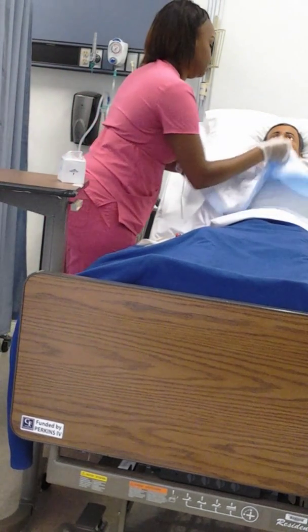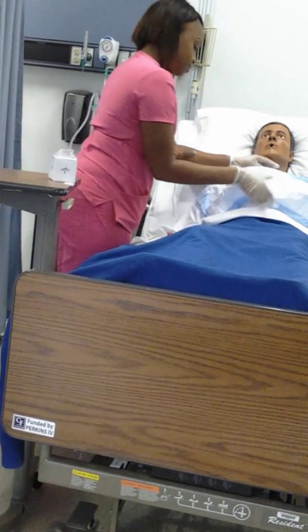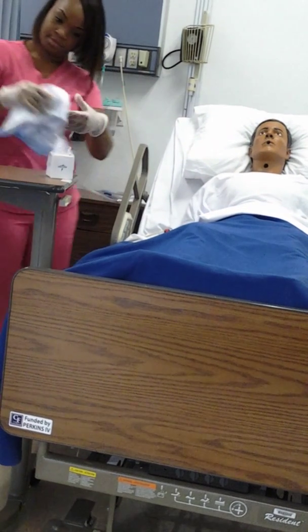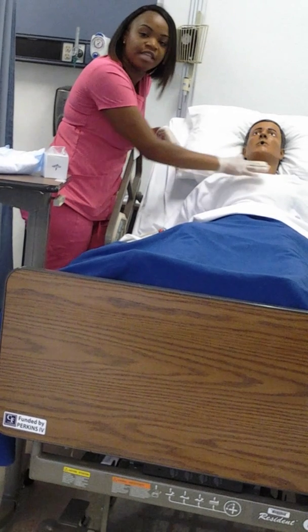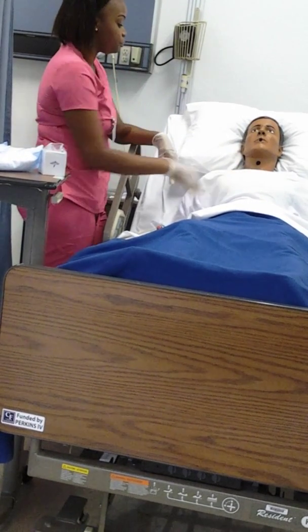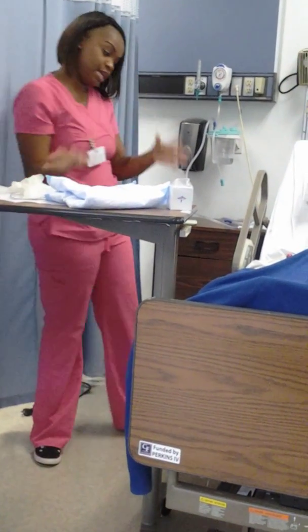Take my chucks and kind of wipe away the patient. I'll put the oxygen back on. Listen to the heart and lungs again. We'll listen to the lung sounds again to see if it was effective. Take my gloves off. Wash my hands.